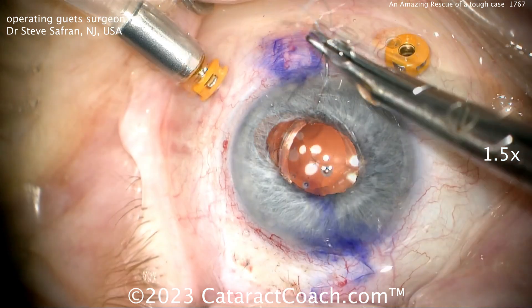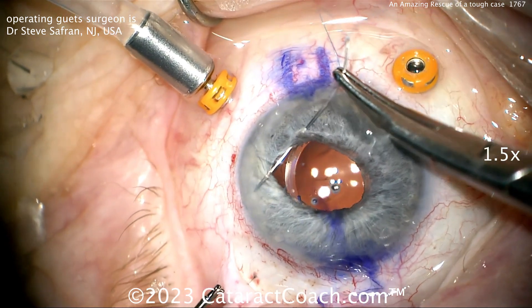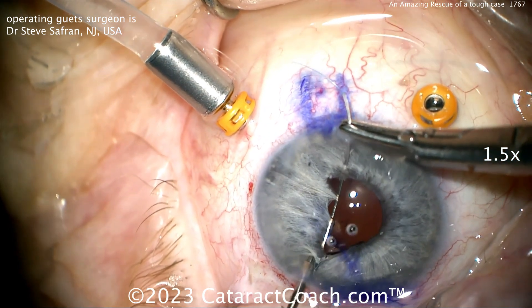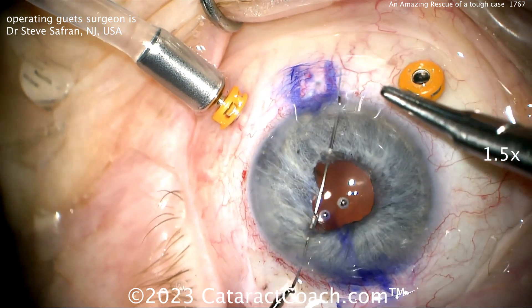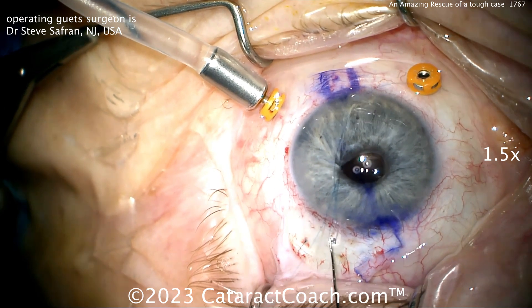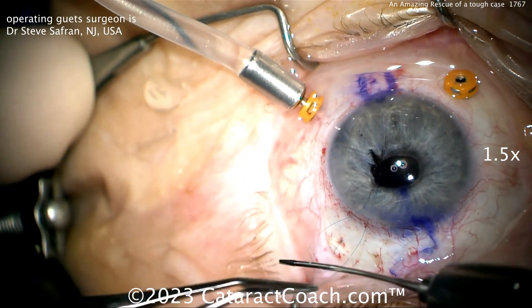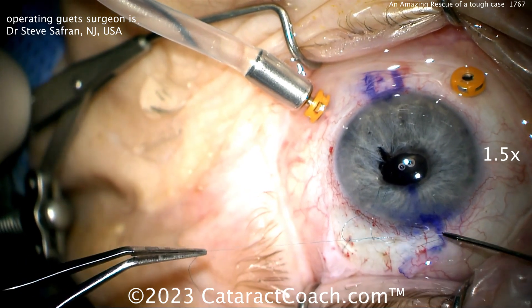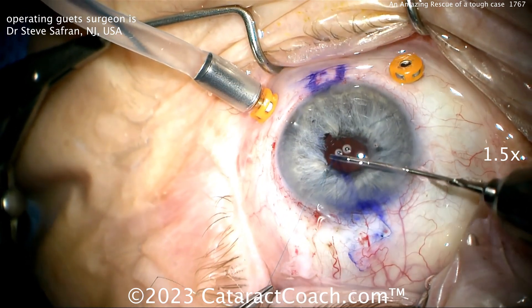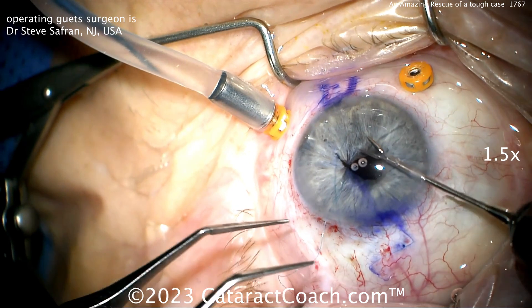Now it's time for some iris repair. The surgeon, Dr. Safran, changed positions — he scooted up and is now sitting superiorly, just to make this procedure easier. Using 10-0 prolene on a long needle, externalizing that, doing a little mini running suture — not a full purse string for 360 degrees, but just for about 90 degrees. Pulling both ends outside the eye, this can be tied using the four-throw pupil cinch technique or a 4-1-1 for extra security. Bring that knot inside the eye — with one forcep in the eye pulling that side and the other forcep outside, get that knot cinched down to the appropriate size. Make a reasonable pupil: don't make it too tiny, you still want to be able to dilate the patient and examine the posterior segment.